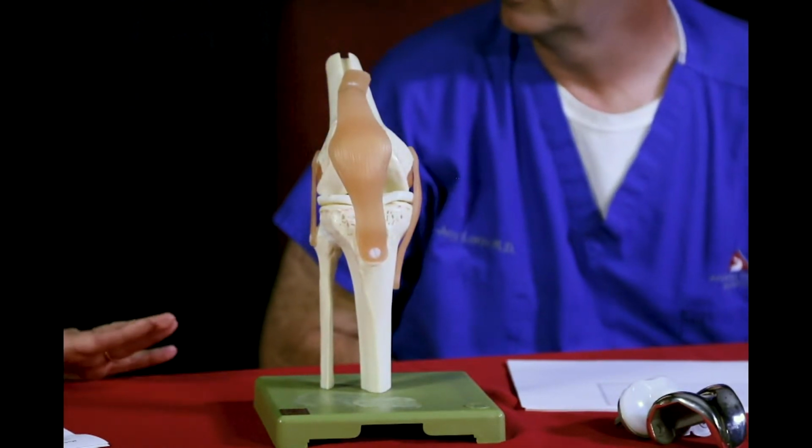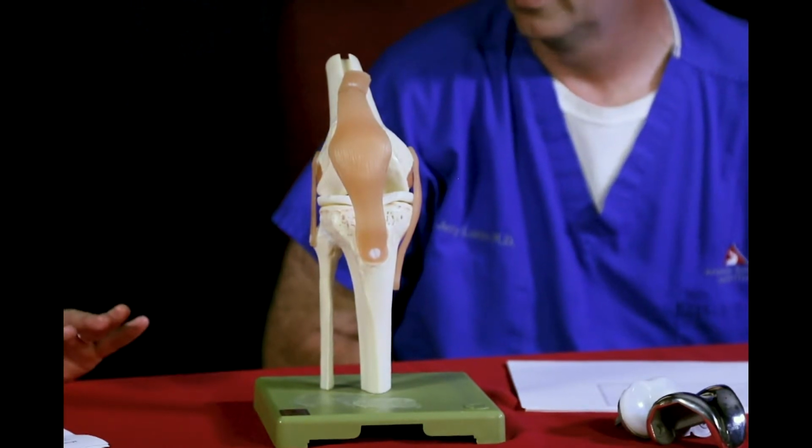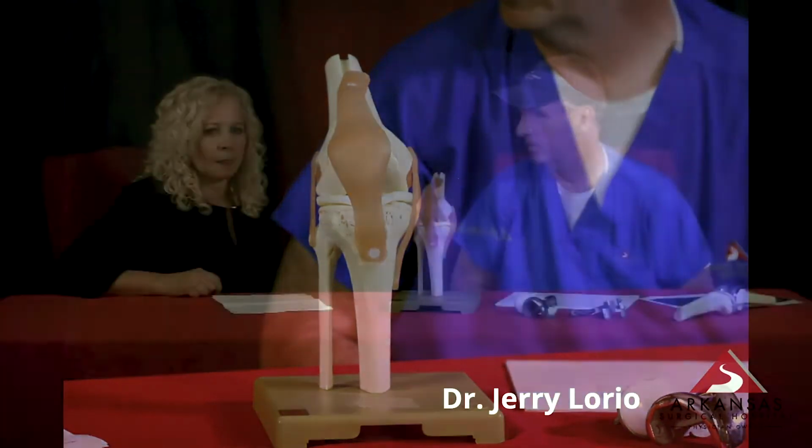Okay. So are you doing this for a full knee replacement or partial knee replacement? Yeah, I'm only doing a full knee replacement now. I used to do the partial knee replacements, but they just did not perform as good. The 10-year results were 90%, and over time I felt like I revised every one of them and turned them into a total knee. My total knees did way better than the partial knee, so I abandoned it.